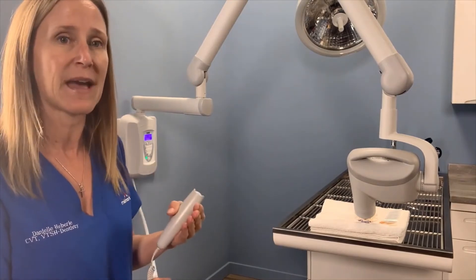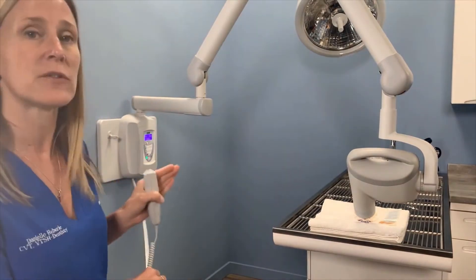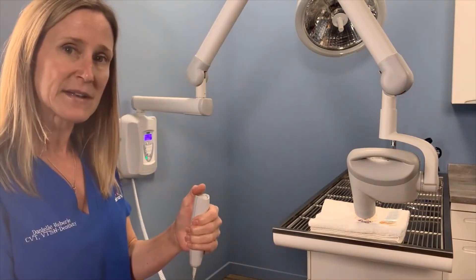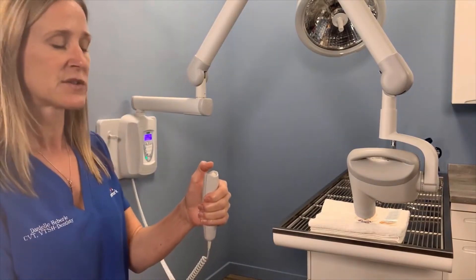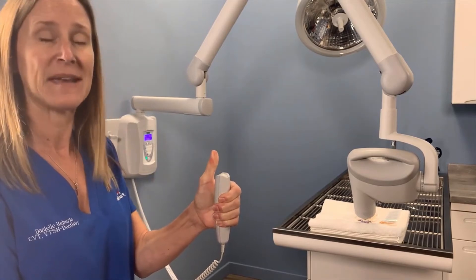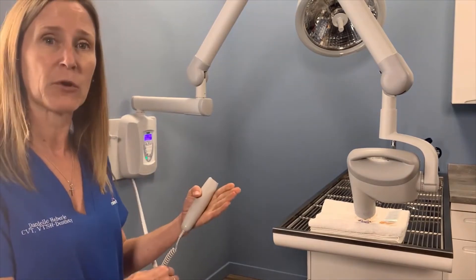So if you do hear that indication, you'll wait for the machine to reset itself. Then hold this button down until the beep stops. The beep stopped — now we can let up. And now we will get our image.